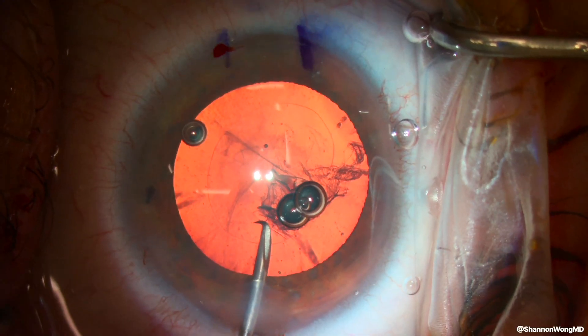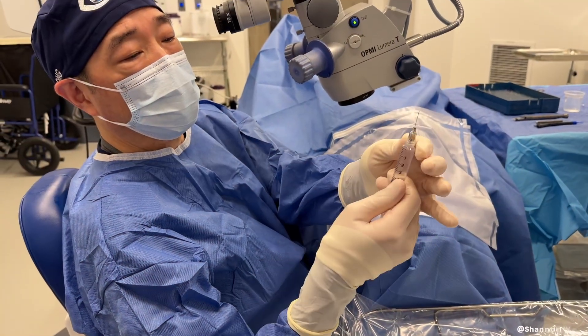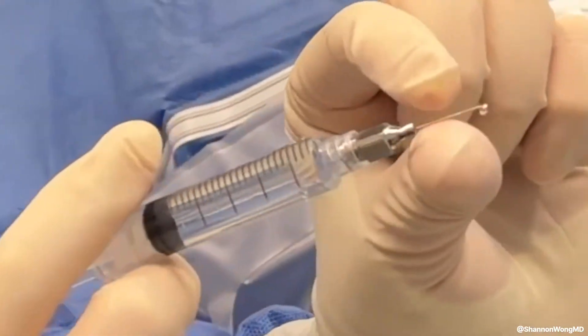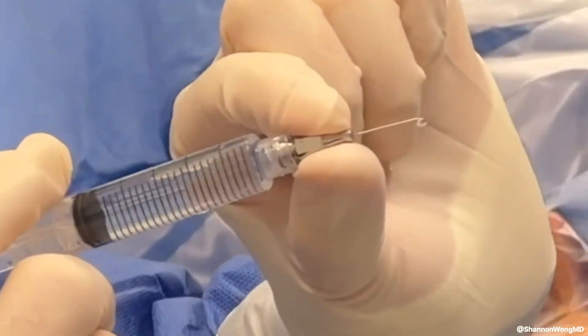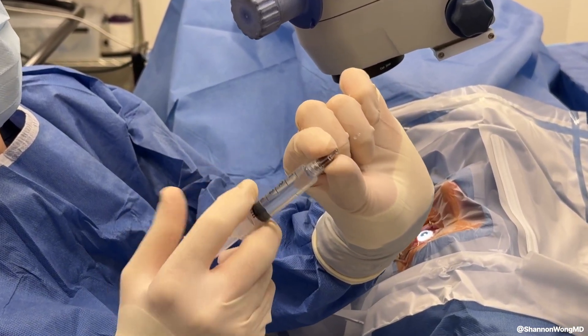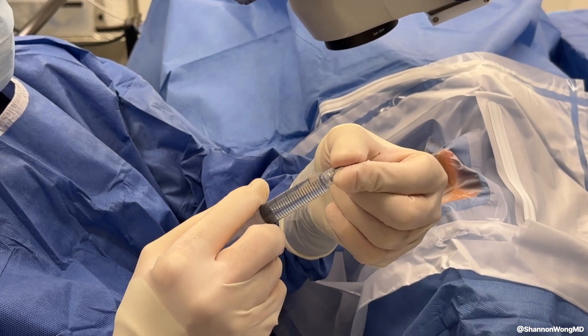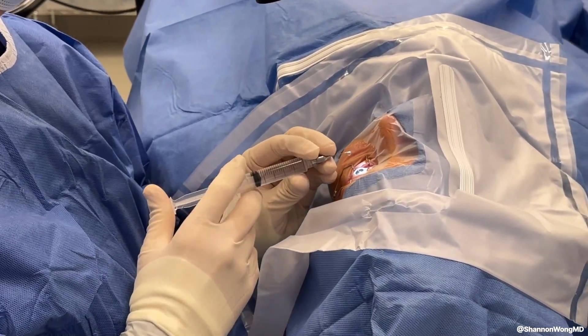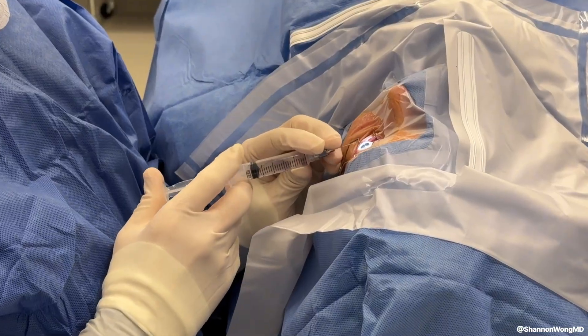This occurred because the cystotome was ejected from the viscoelastic syringe. When a cannula is secured to a syringe, I hold the cannula secure against the syringe as I'm infusing fluid into the eye. Using this technique, it's not possible for the cannula to propel away from the syringe and torpedo into the eye, which may damage intraocular structures.